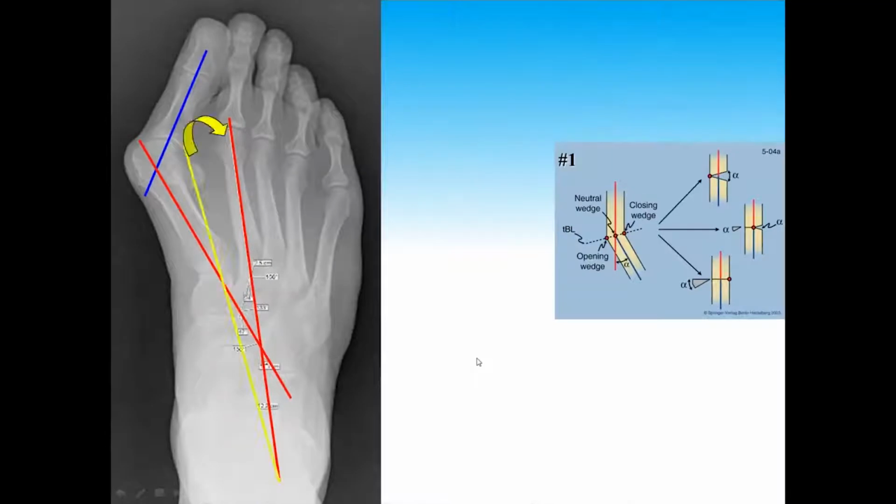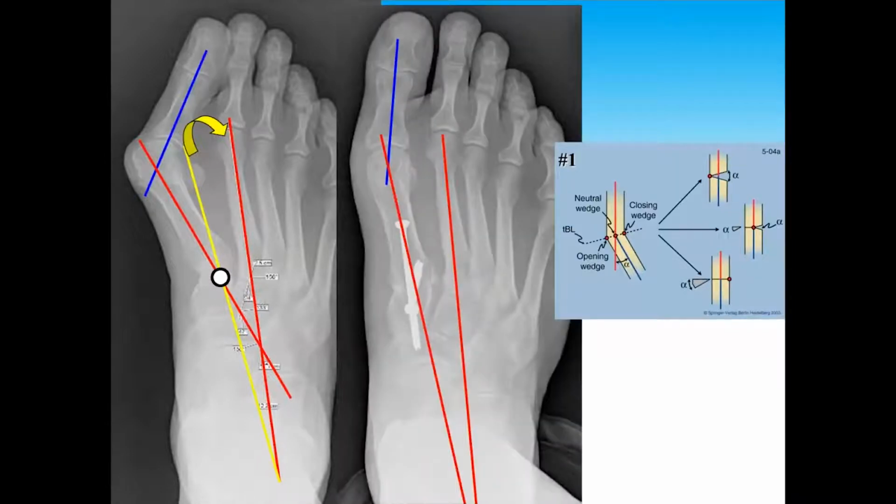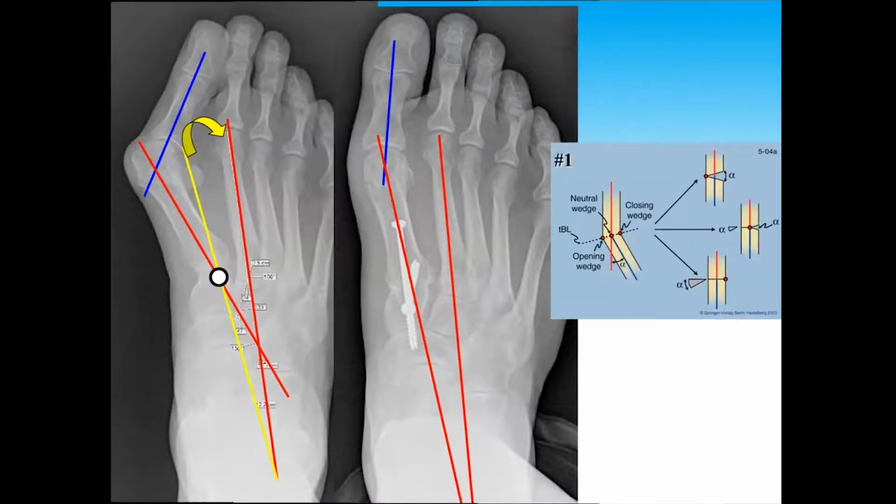Let's take an example. Here's a typical hallux valgus deformity, and we found that our CORA, or apex of the deformity, center of rotation angulation, is at the Lisfranc joint, and we want to correct the red line to the yellow line. We do that via Lapidus procedure, and that basically corrects your deformity. Osteotomy Rule 1, not only is the apex or CORA at the Lisfranc joint, but also your osteotomy realignment is the Lapidus fusion at that level. Osteotomy Rule 1 is a good rule.